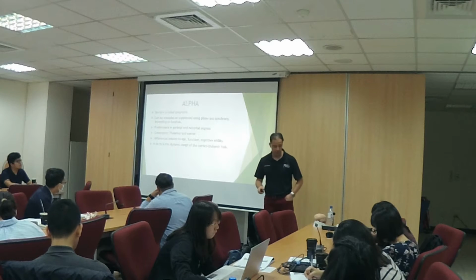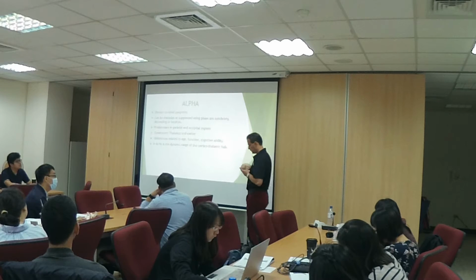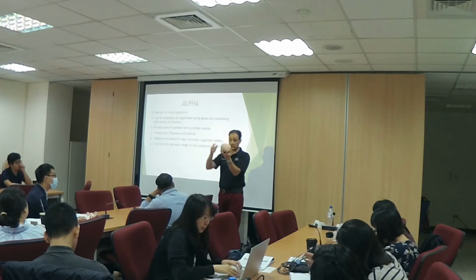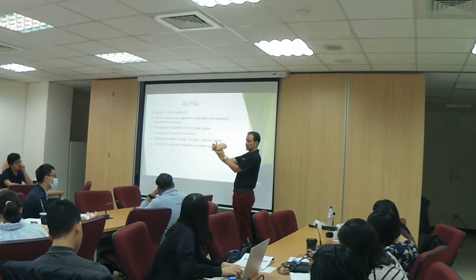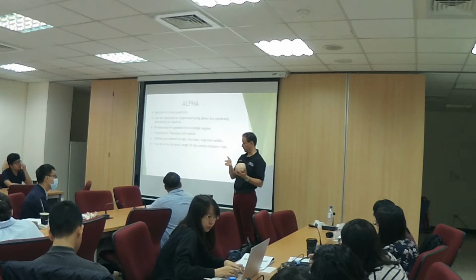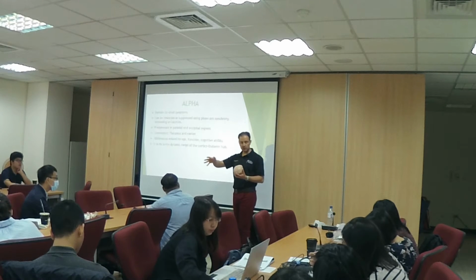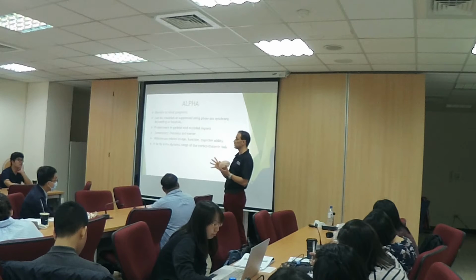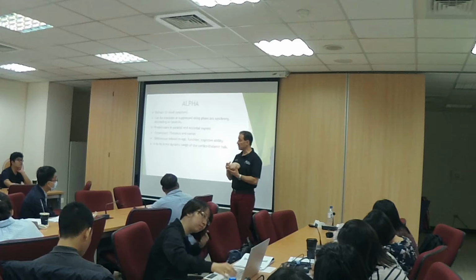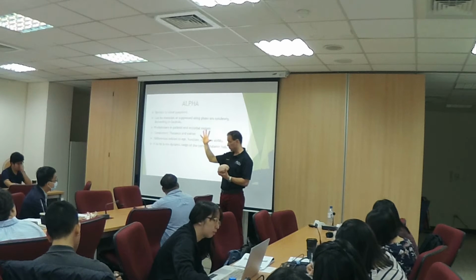And that brings me to an important point. When you're looking at the EEG, you want to focus your attention in part at PZ. Okay? So your parietal midline, because that's called the alpha background rhythm. All right? So that's your baseline rhythm, which is an indicator of self-regulation. Now, alpha with the eyes closed is going to be greater than the alpha with the eyes open.